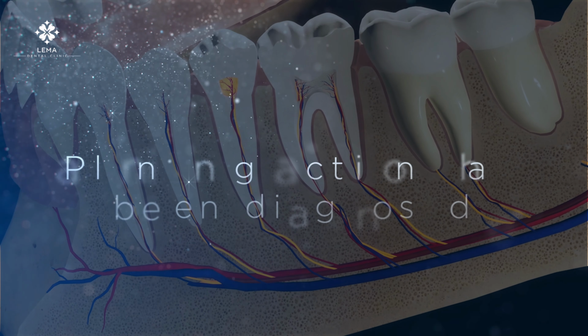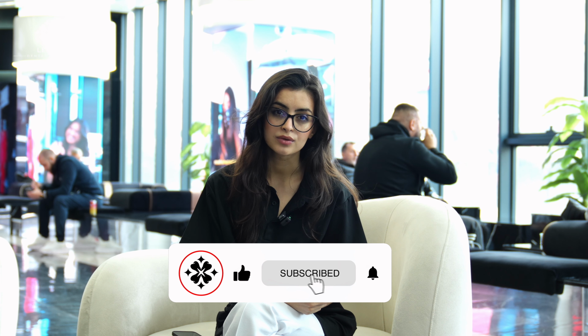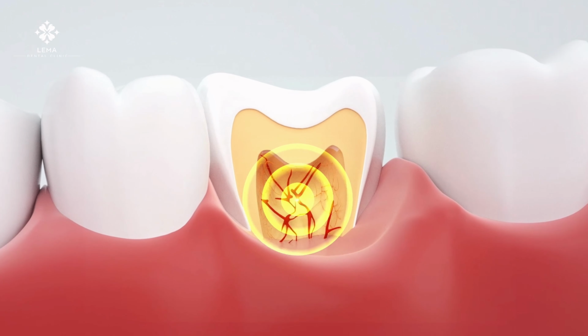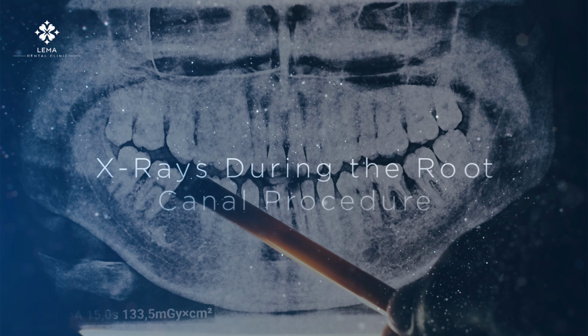Planning the treatment with X-rays. Once the infection has been diagnosed, X-rays help your dentist plan the root canal procedure. They allow the dentist to see the exact shape of the root canals and how many canals are involved. This is especially important for determining the right tools and techniques for cleaning and shaping the canals. X-rays also provide an accurate view of the tooth structure, helping the dentist avoid any damage to the surrounding tissues during the procedure.